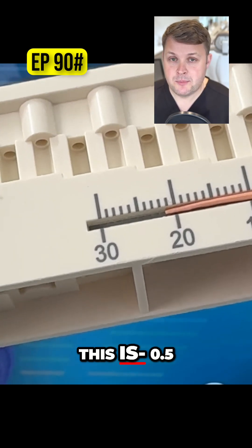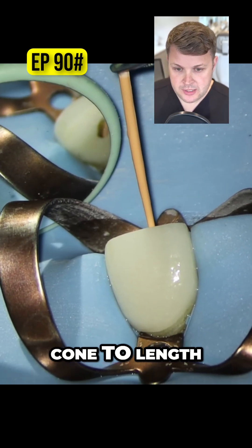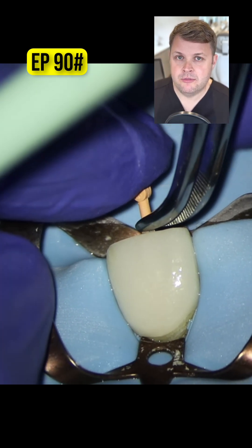This is minus 0.5 millimeters away from the zero reading. And then we place the GP cone to length — we can kind of feel that lovely tugback.